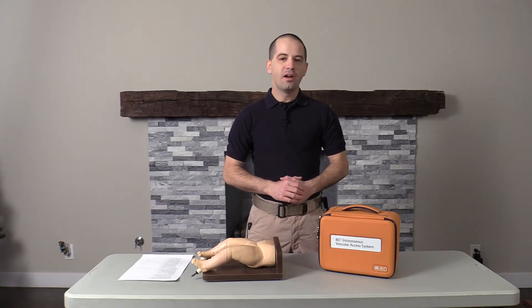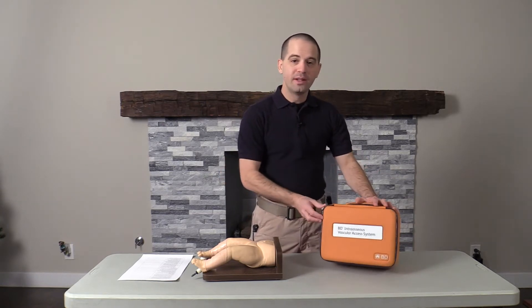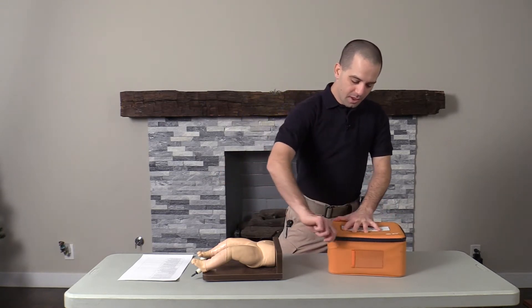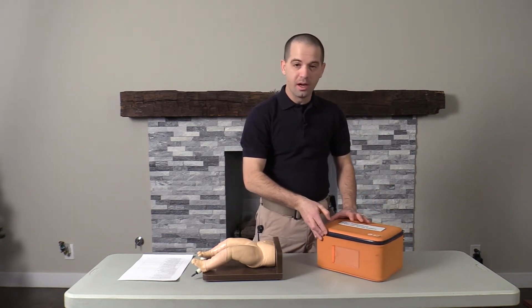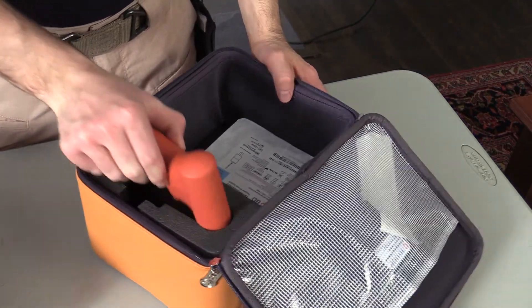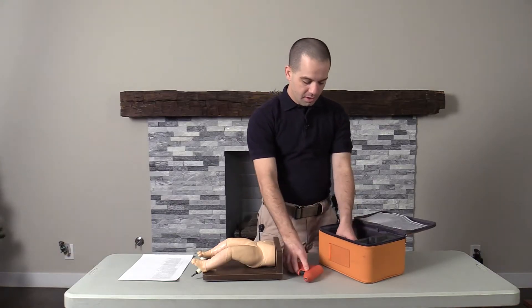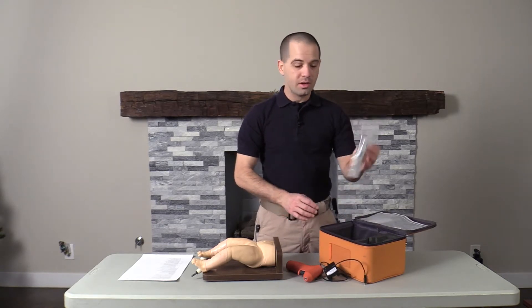So today we're talking about the BD I.O. vascular system. Let's dive into this bag and see what's inside. This is the carrying case that actually holds the BD I.O. gun. When you open it up, you have the BD I.O. gun, a charging cable, which we're going to talk about momentarily, and all your I.O. needles.